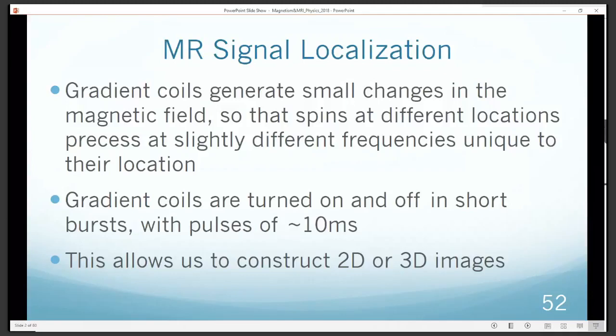And so you can't localize precisely with that large a wavelength. So what you can do is think about what characteristics electromagnetic waves, and in fact all waves, have, and it comes down to three. You have amplitude, you have frequency, and you have phase.